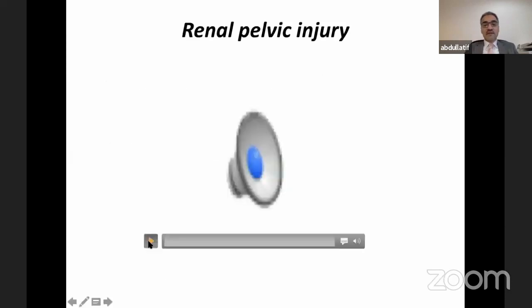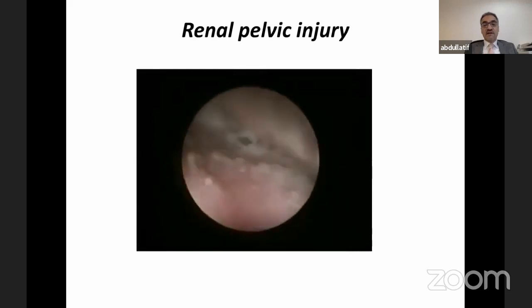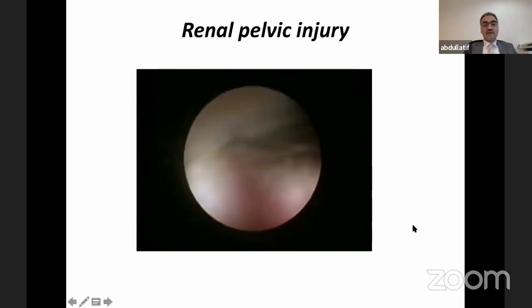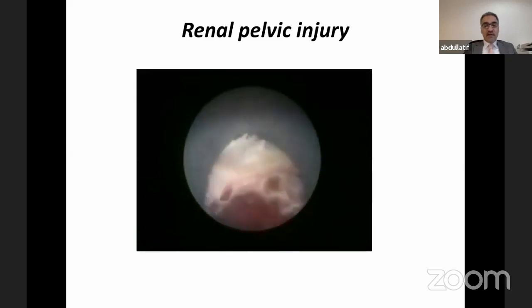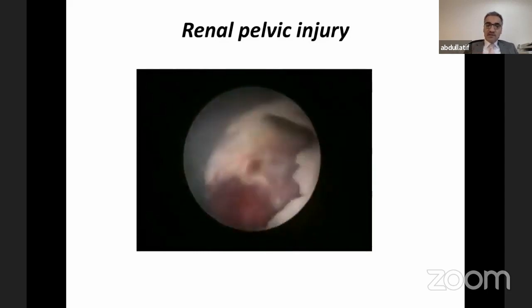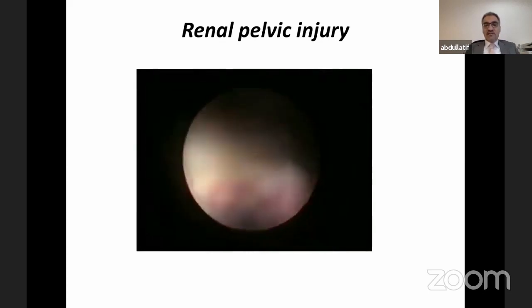This is a video I'm going to show of a large perinephric extravasation. If you look, you're going to see shortly a fragment, a stone migrated out, and you can see the sheath being pulled back so it can go back into the system. Obviously, this is a large rent into the pelvis. Also, the vision is not very clear because not a lot of fluid is coming back. So you're getting a multitude of signs that you've got a large perforation.